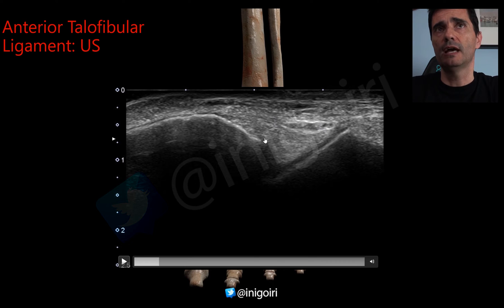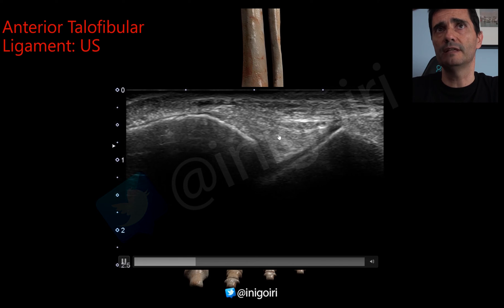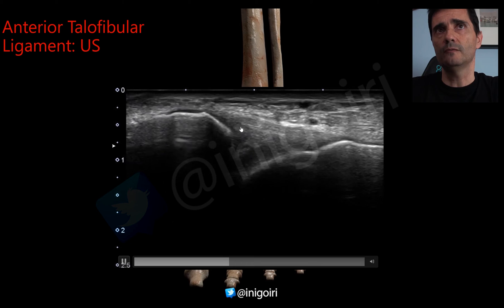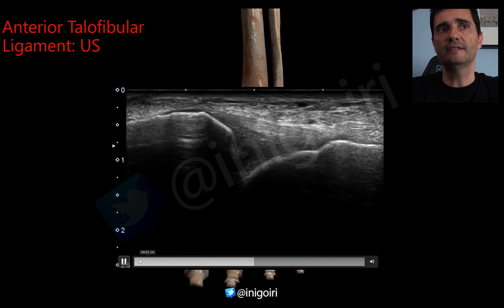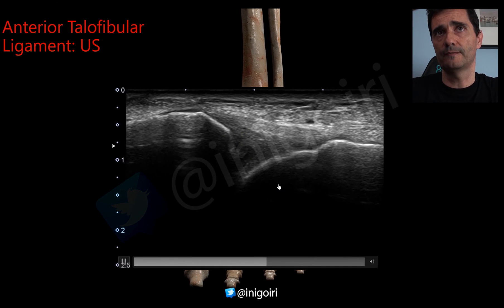That hyperechoic structure is lateral fat, and this is the first image you need to see. Once we have this image, properly oriented with the same axis as the sole of the foot, we move the probe upwards and downwards until we see a tense ligament with fibrillar pattern. This is a normal ligament with a slightly hypoechoic image compared to the fat, with a fibrillar pattern. Below we will have the joint, because this ligament is a reinforcement of the capsule.